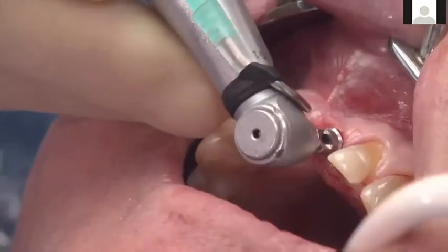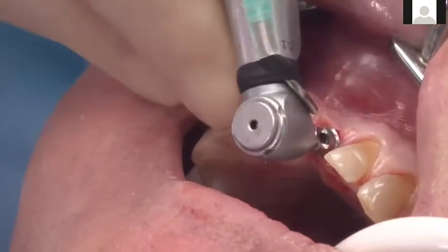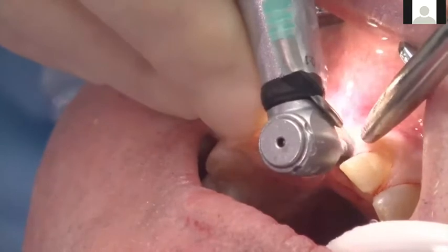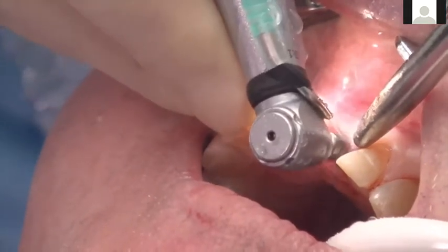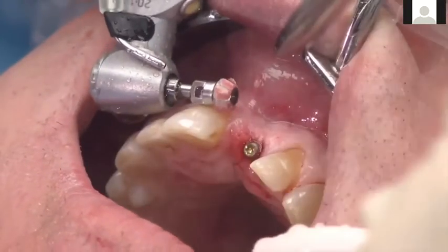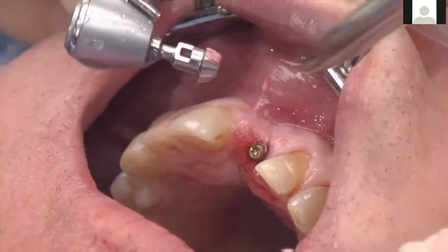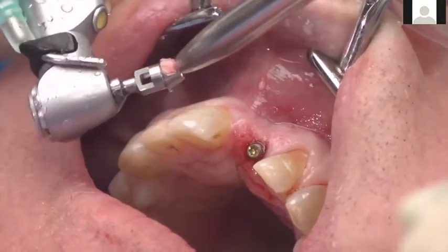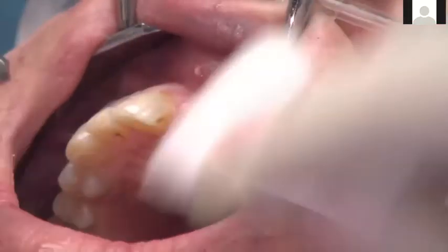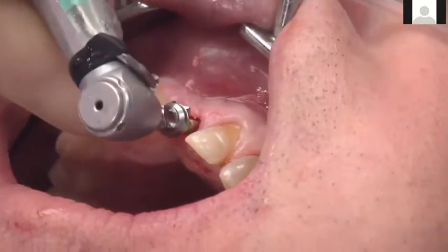And here you can see we have placed the bone profiling pin, and this is the guided bone profiler after the implant is in place. And what I like to do is that I like to not use the biggest size initially. In this case, because this is an anterior case, we would use a size 2. In an anterior, if it was a lateral, just a size 1. So this is just a size 1 initially, because I want to see how the size 1 and 2 make sure that they don't remove any papilla. And then now this is the size 2 that is placed.